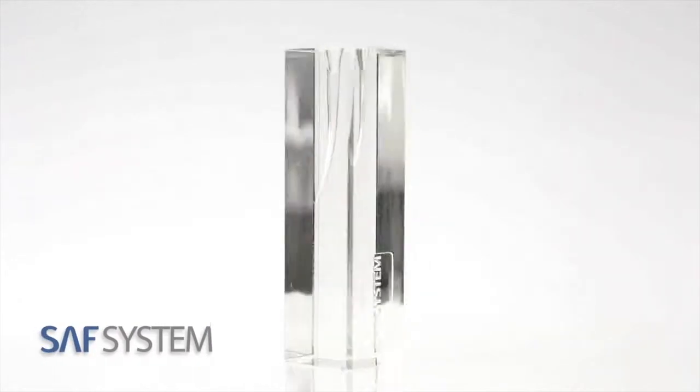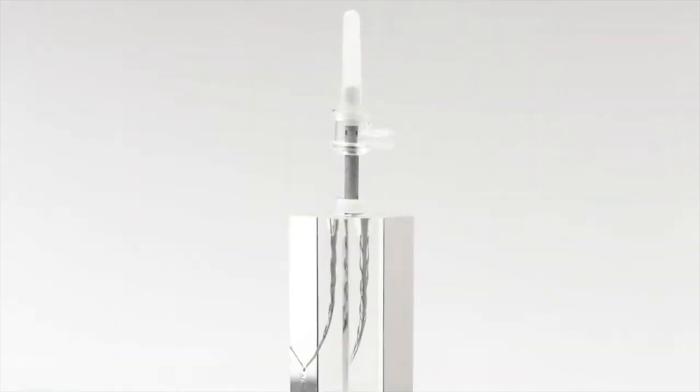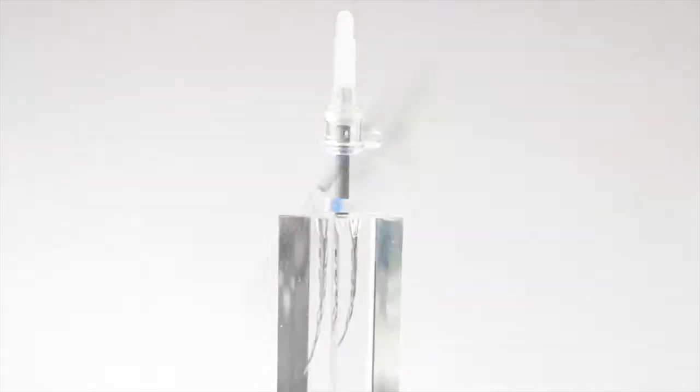The self-adjusting file system, based on a hollow file that adapts itself to the irregular shape of the root canal, overcomes many of the current drawbacks of rotary file systems.